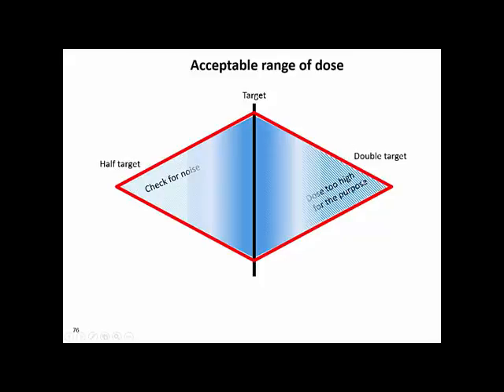On the right side, we have an area where we would say the dose was really too high for this purpose, for this question, but don't repeat because the image will look nice. This is just a case of, let us call it, wasted dose for this kind of question, purpose and patient. On the very left side now we have real low exposure index numbers, where we would really say if it's below a certain limit, the user should really consider to repeat this image.